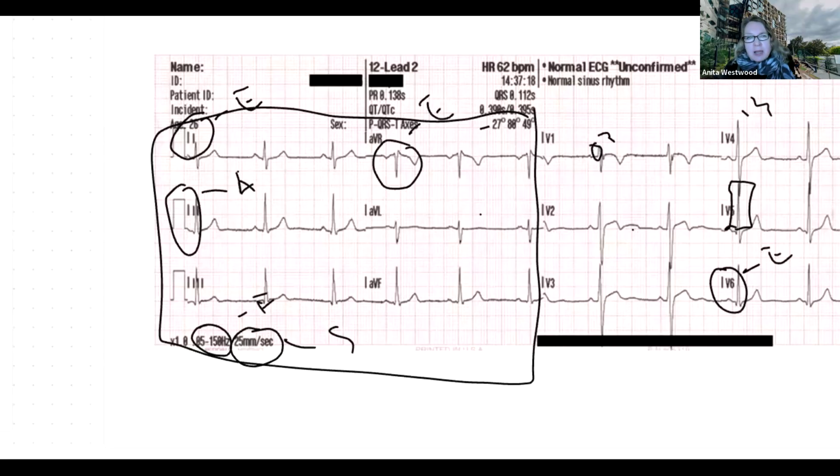We may not see that if we haven't got our precordial leads on there. That's all a 12 lead, and then if you go to a 15 lead, all it allows us is that extra view. Does that answer the question or help at all? It's a hard concept, I know. It is hard. We've all struggled with this ourselves.